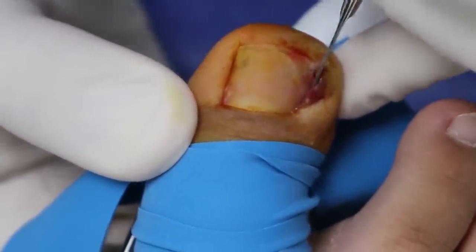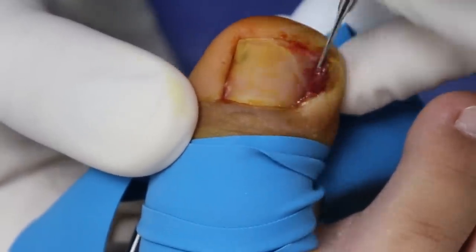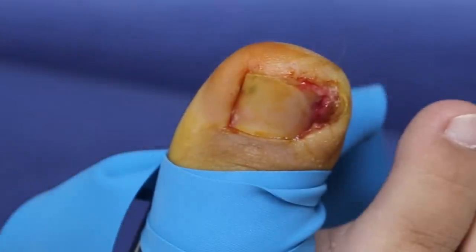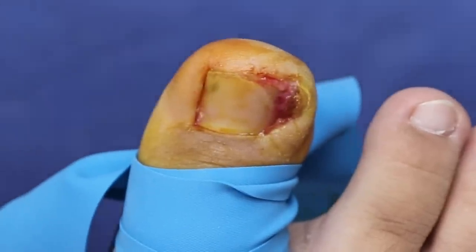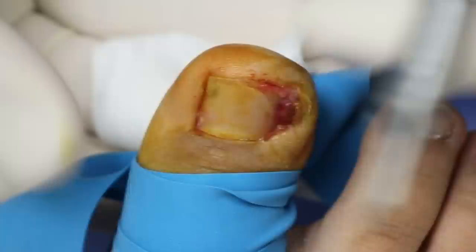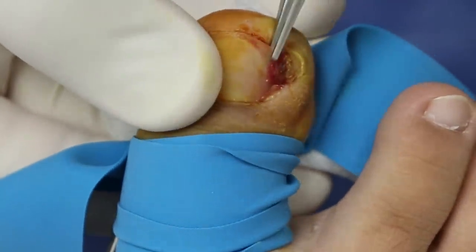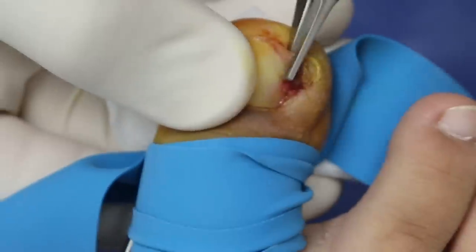So we can see that corner — the nail completely cracked at the tip. It's going right into the skin, and that flesh has grown right over it. If you need a break, just put your head back and relax. But what we're going to do is take out that bad part of the nail.